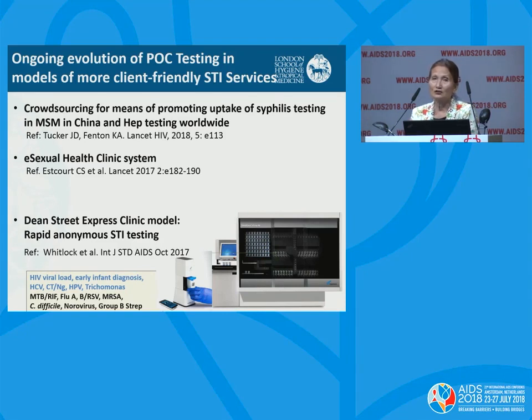In fact, you come into the clinic and you input your information and why you want to come here on a computer, and the computer would direct you to a room where you are instructed on how to take specimens through a video, etc. And so it's very, very user-friendly, and because the test result could be ready in an hour and 45 minutes for chlamydia and gonorrhea, you could either wait or you could go back to work and your results will be on your phone and you'll be directed to what to do next.